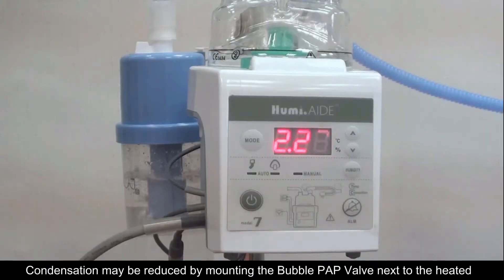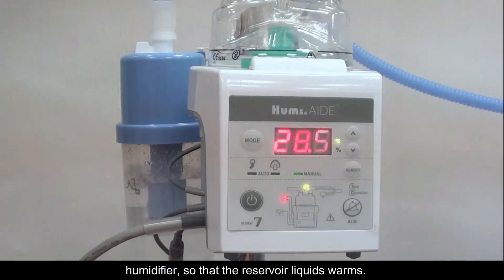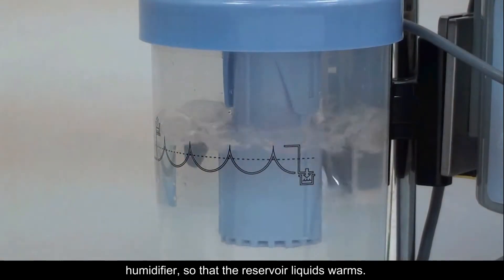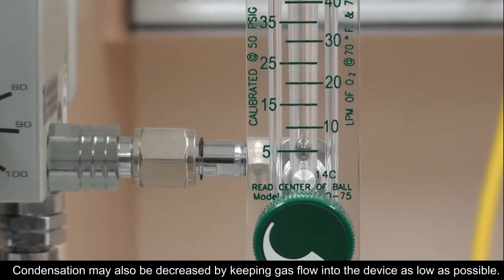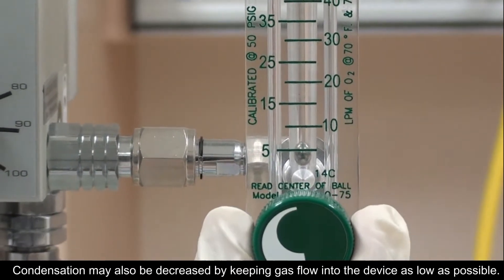Condensation may be reduced by mounting the Bubble PAP Valve next to the heated humidifier so that the reservoir liquid warms. Condensation may also be decreased by keeping gas flow into the device as low as possible.